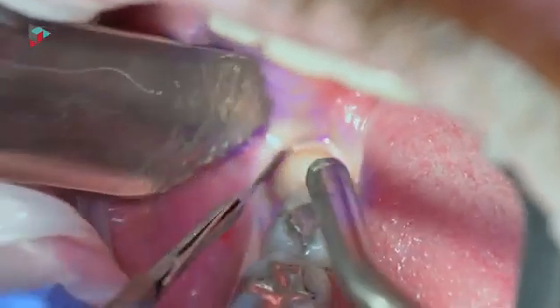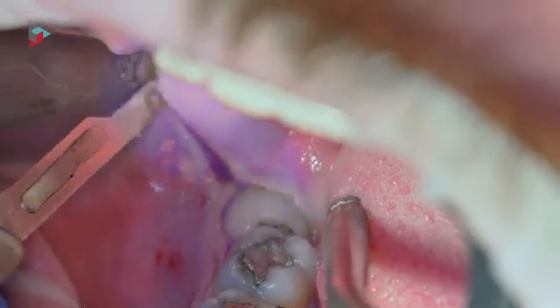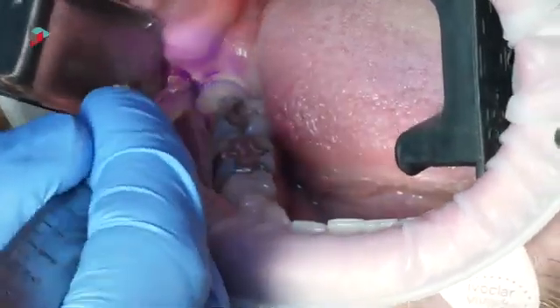We are looking at a good example of a tooth sectioning surgical procedure, and in this case, it's used to remove this impacted wisdom tooth.